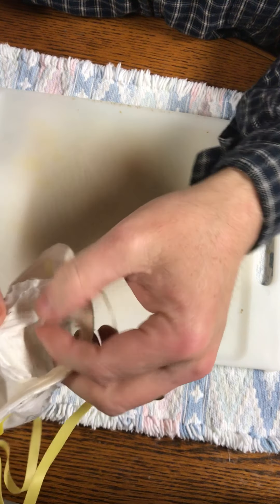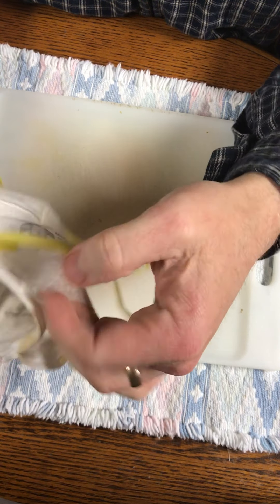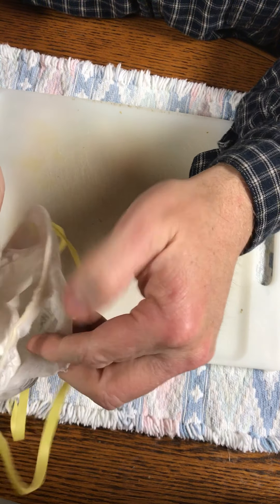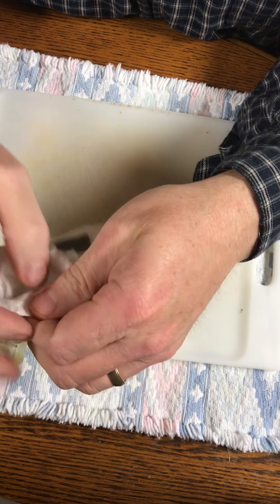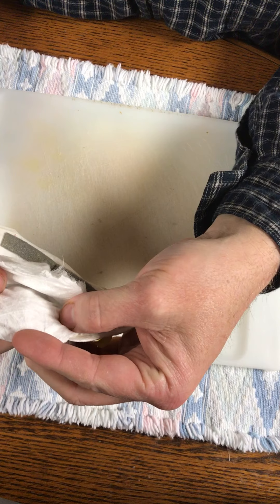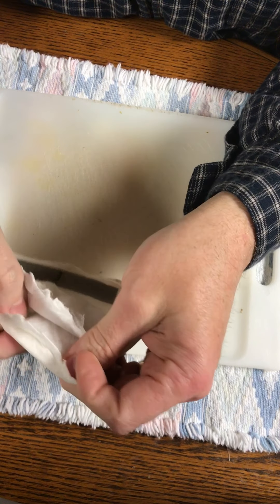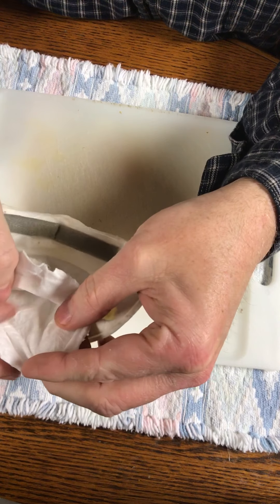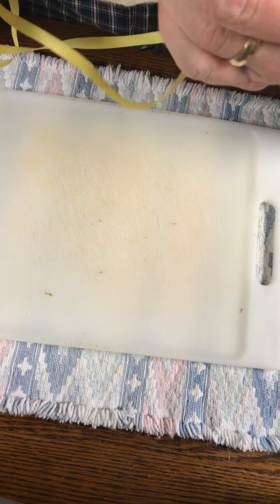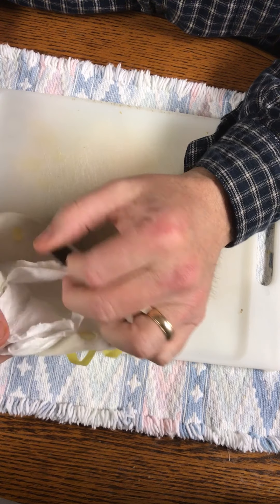The outer layer is this really thin stuff. I think the secret and the magic to this mask is the middle layer because you can barely breathe through it. I pulled one layer off - let me see if I can breathe through just one layer - very easily. About half the work, but when you double it up it's hard to get through it.